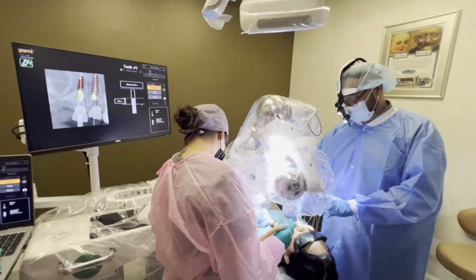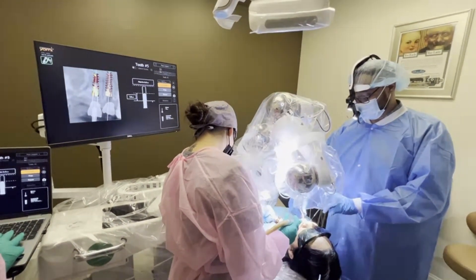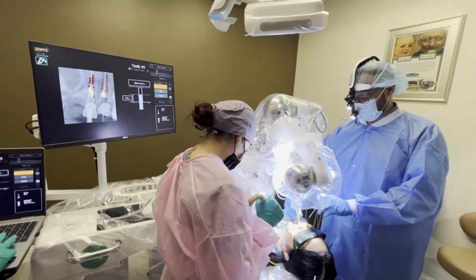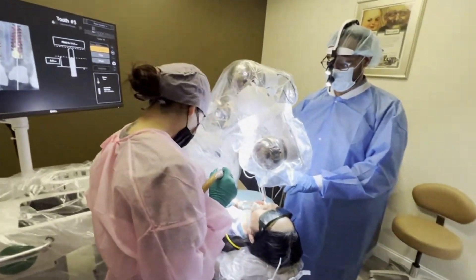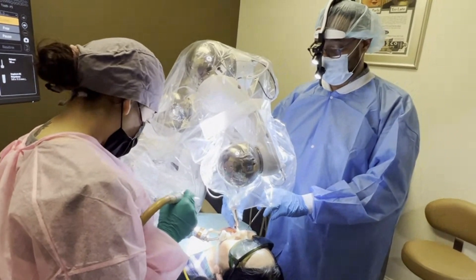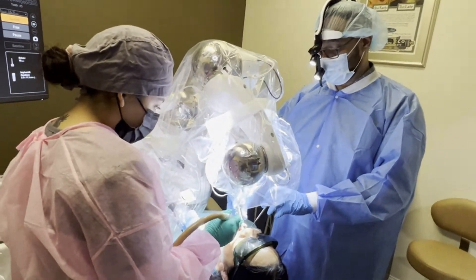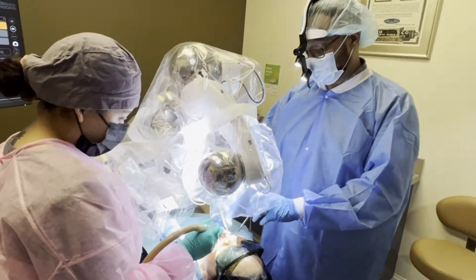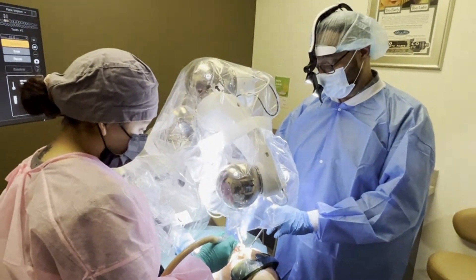3, 4, 5, 6. If you notice, see how easy it is on my hand — because it's not going to deviate from the path that has already been coded in the software.